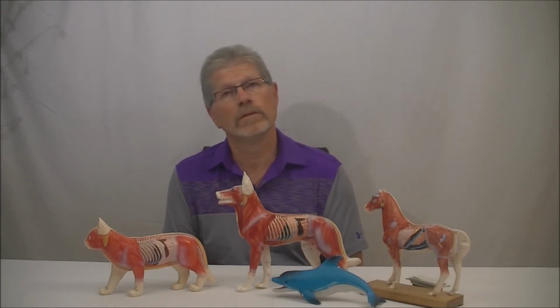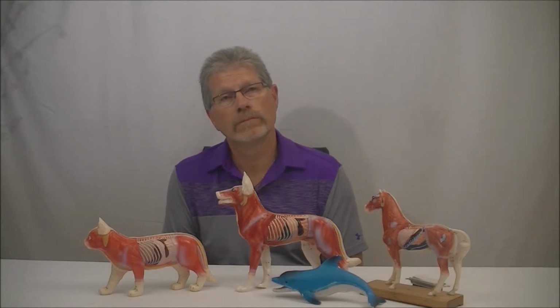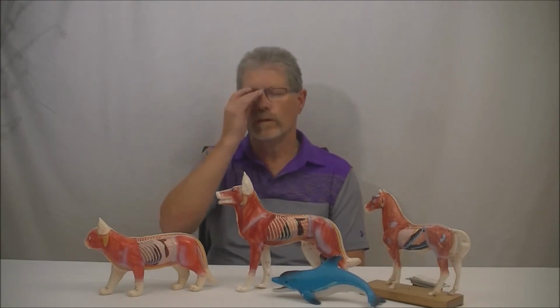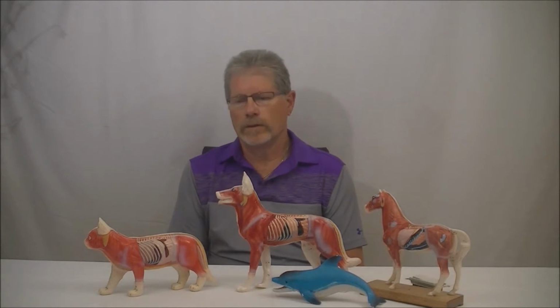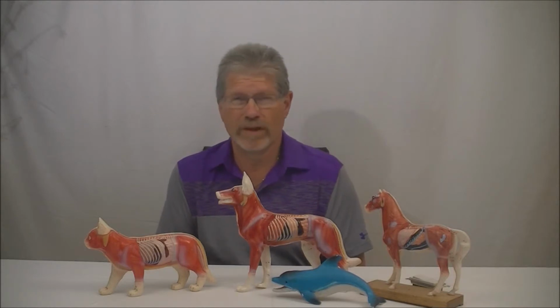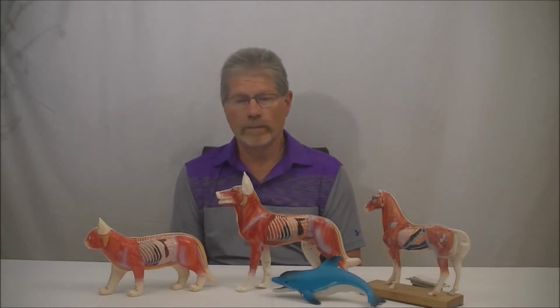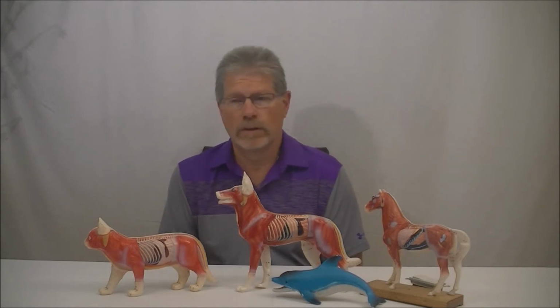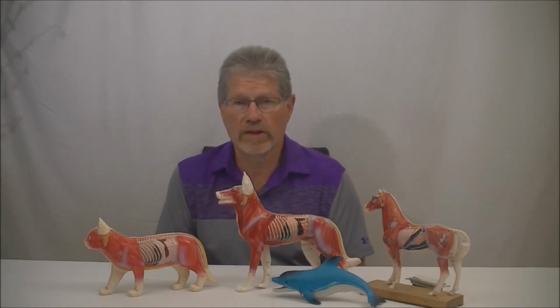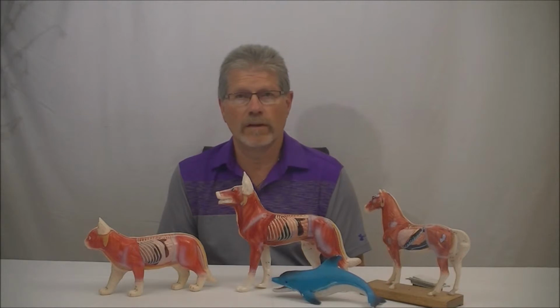So give me a quick rundown on some of the conditions that you might use your laser for, the Class 2 laser, as opposed to the Class 4 lasers that a lot of veterinarians are carrying because a sales rep comes in one day and says, oh, you've got to have this, it's the latest thing, you can charge a lot of money, good to go. That's huge. I don't know all of what, say, a Class 4 sales points are, but neurology cases, paraplegics, hemiplegics, spinal disc problems. If that spinal cord is not dead, it can be rehabilitated.